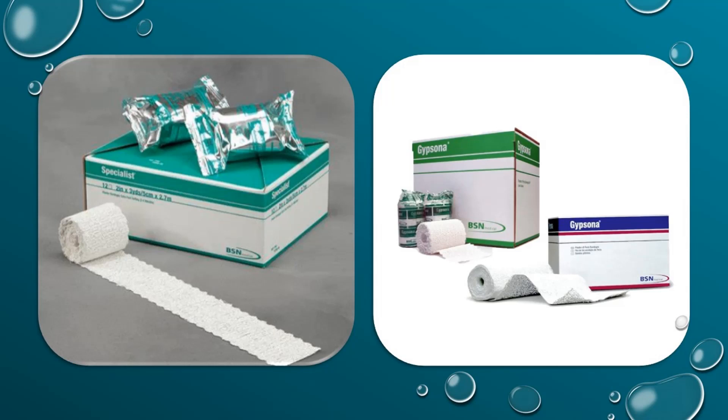If you are in different departments or facilities other than main campus at Atrium Health Wake Forest Baptist, rolled plaster of Paris may be available to you. The general technique when splinting or casting still applies. Select the material and size needed, apply padding to the patient with a total of three to four layers, immerse the roll in warm water and squeeze the excess water out. Using the rolling out technique, roll or create sheets with a total of eight to ten layers, and if you are creating sheets, use an ace wrap to secure the plaster.